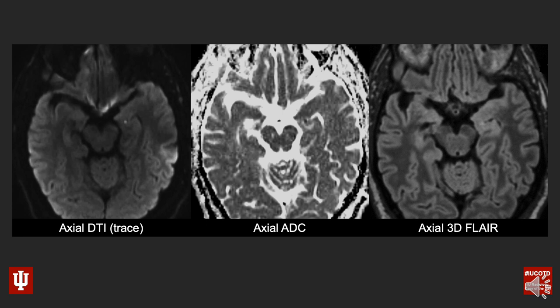The image in the middle is an axial ADC map that corresponds with the same location and same slice, and then the image on the right is an axial 3D FLAIR. So take just a few minutes to look at those images — again, keep in mind the history here was an acute episode of confusion. Try to put that all together.